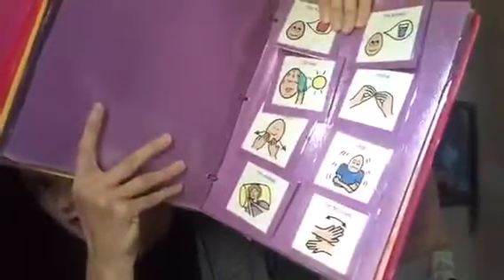There were even some academic things in here, like for instance, seasons. And I think there was some sign language, even some sign language on this page. So a lot of different things that Melanie could choose to communicate with. Again, we were just using the same concept of taking the picture and exchanging it, so that she would know that this is a way that she could communicate with us.